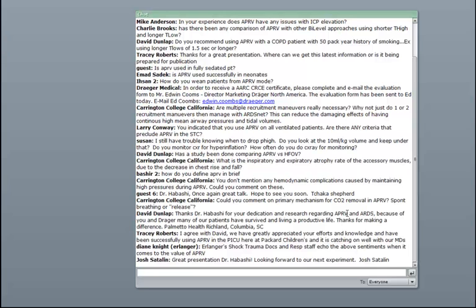The chest x-ray can also be used because we can look for flattened diaphragms, and we try to ensure that the diaphragms are not flat, because certainly there's lots of other things that give you that, not just the ventilator mode or the settings. It's also the airway resistance, whether it's from the native airways or the endotracheal tube, from kinks, from secretions, from the progressive increase in resistance that occurs, so on and so forth.